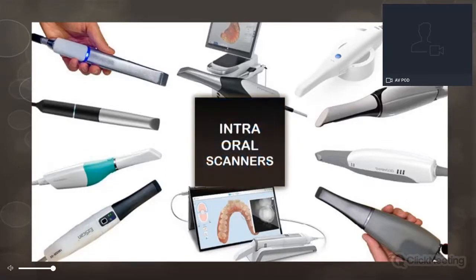At IDS last year, there was a massive release of new intraoral scanners. Now, it doesn't really matter what intraoral scanner you use. The important thing is to use it correctly so that you can achieve a good CAD model and an accurate one with the correct scanning technique. And as long as your intraoral scanner can export an STL, you can use whichever scanner you have.